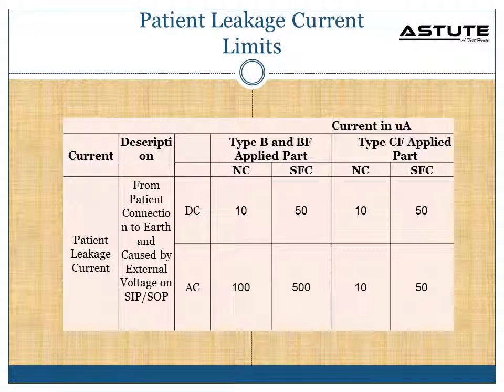Patient leakage current limits for type B and BF applied parts: in normal condition 100 microampere and single fault condition 500 microampere. For CF applied part: in normal condition 10 microampere and single fault condition 50 microampere.